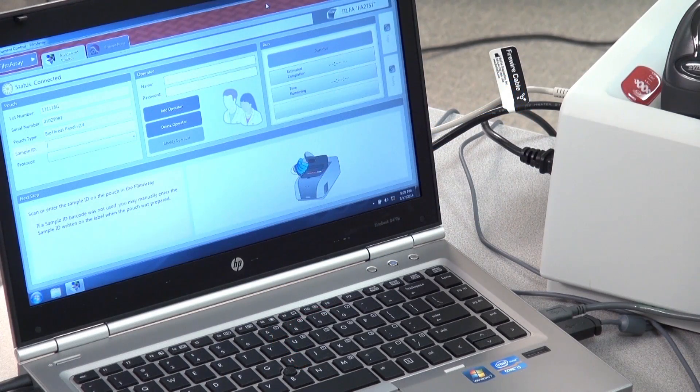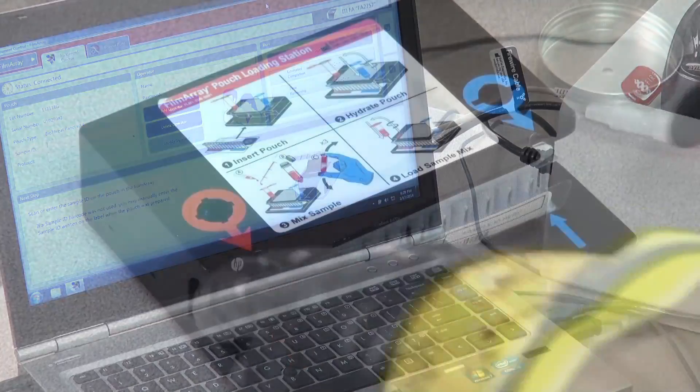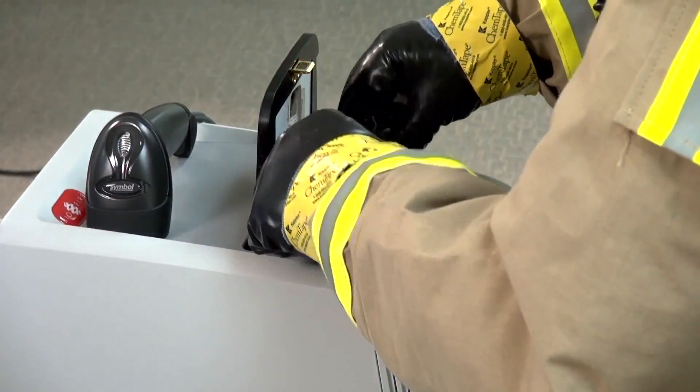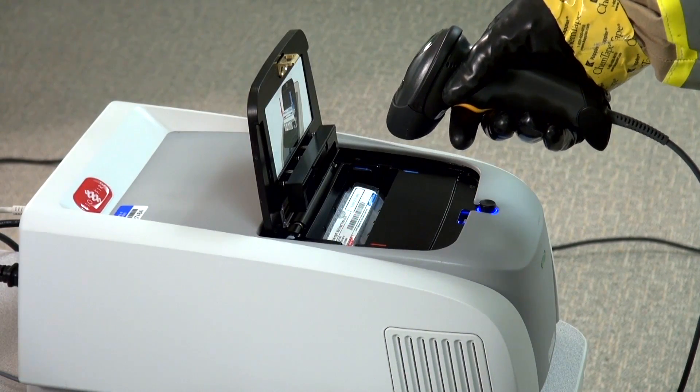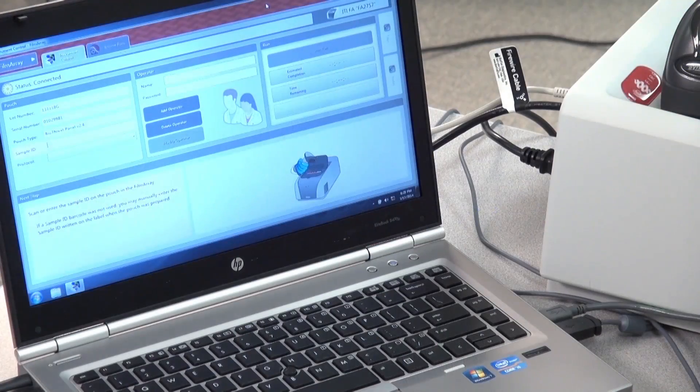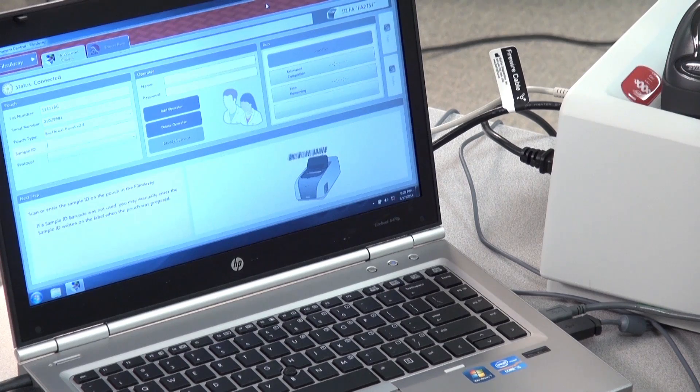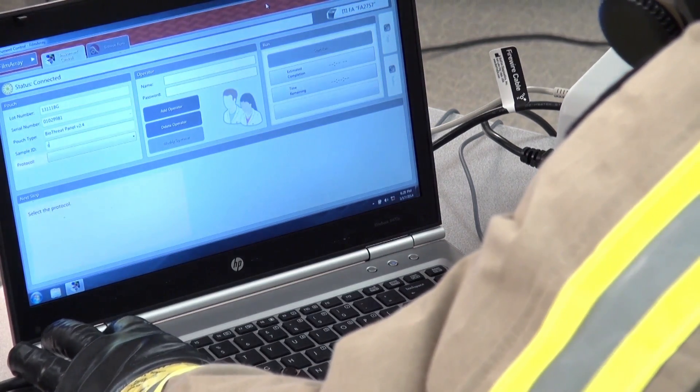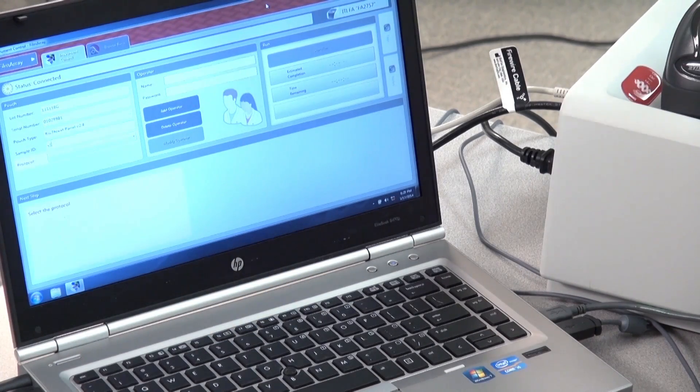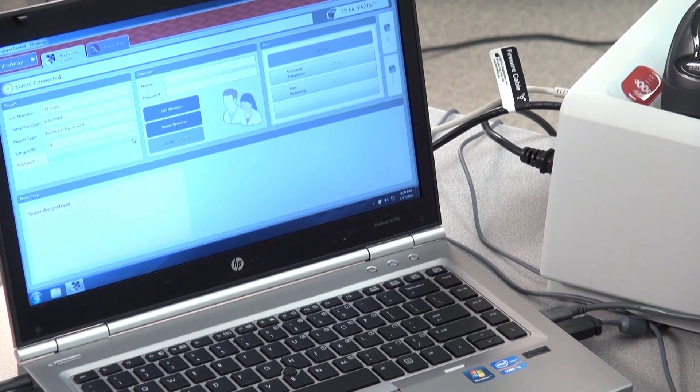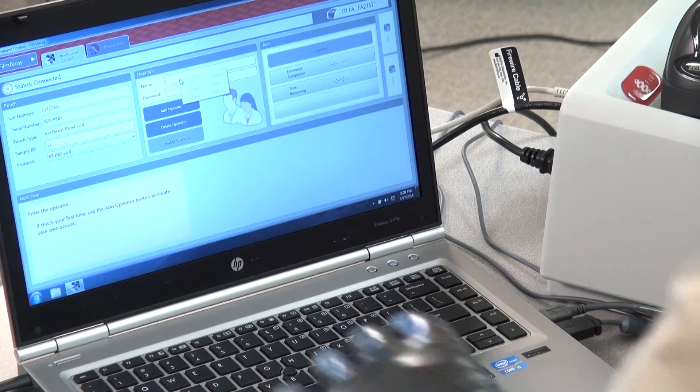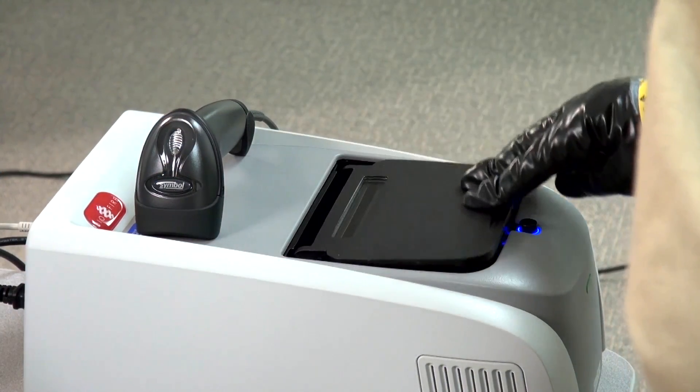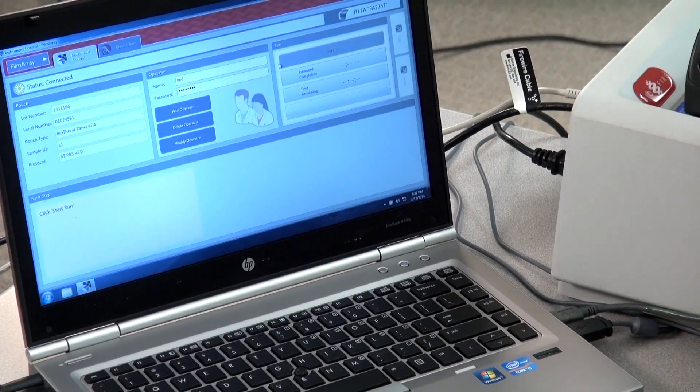Ensure the FilmArray instrument and software are running. Then, remove the pouch from the loading station. Snap the pouch into place and scan the barcode. The software should recognize the pouch once it's inserted. On the screen, enter the sample ID, then select PBS protocol under the protocol pull down. Enter your username and password. Close the FilmArray lid when prompted, then click start run.